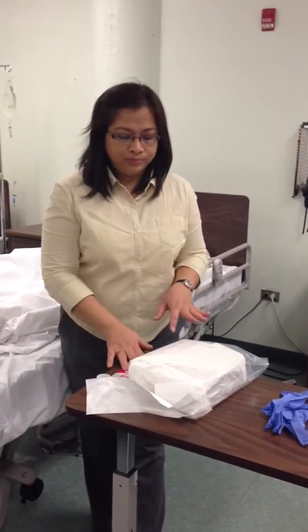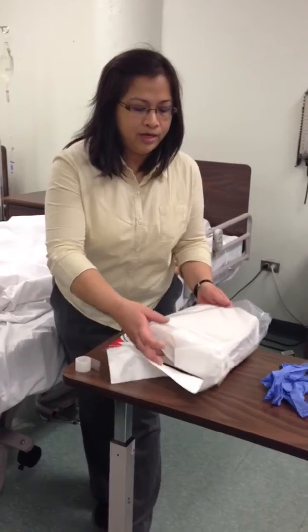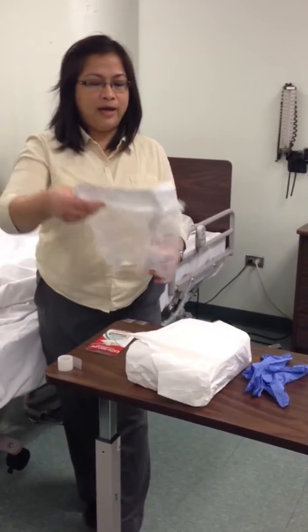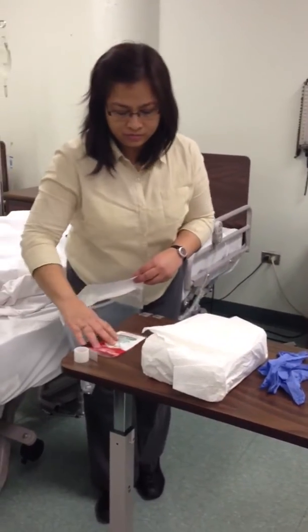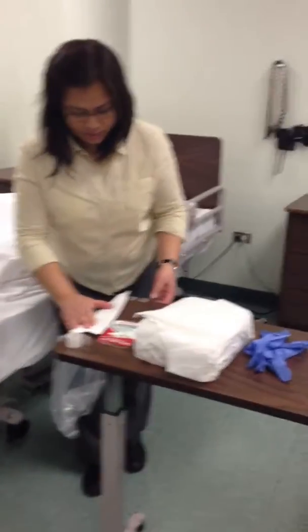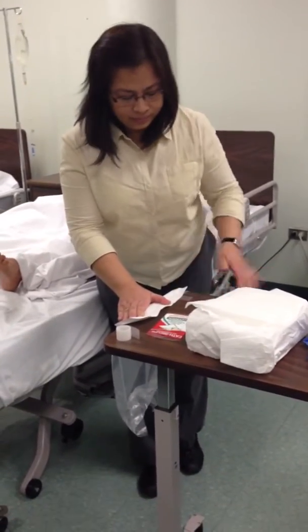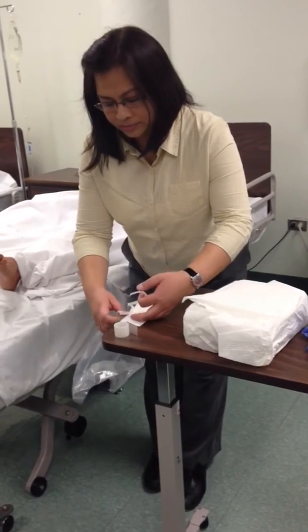Okay. So you prepare your tapes first, and then you're gonna make your garbage bag. The garbage bag is the one that comes packaged in the kit. Make sure you secure this, because you don't want that falling on the ground.